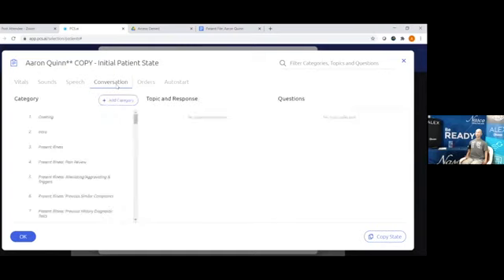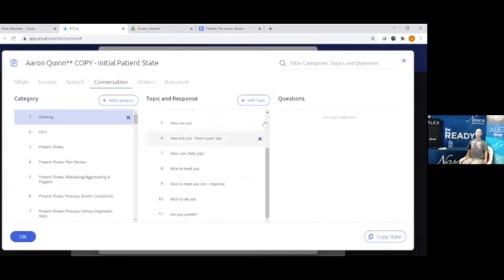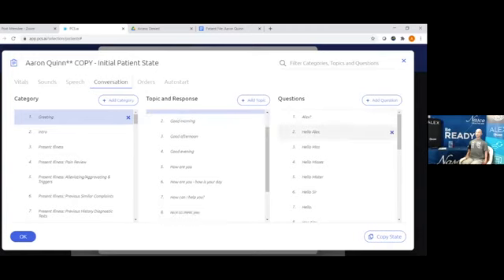which is a little slow right now, I see. Okay. So he works on a category system. First, we'll look at the category of greeting. In your greeting section, there are over 11 topics and responses that Alex has, and we'll just choose greeting on the top one here. So for Alex here, greeting, anytime they would walk up to him and speak to him, you will see there are 22 ways to say hi, apparently in English, to Alex right now.